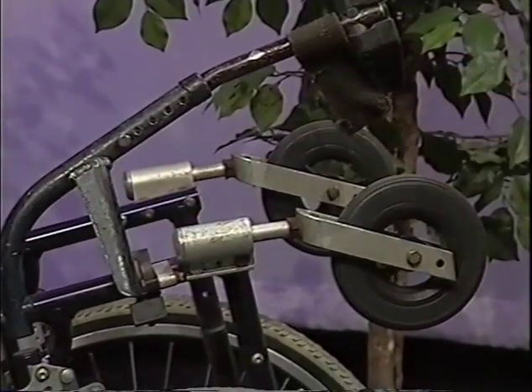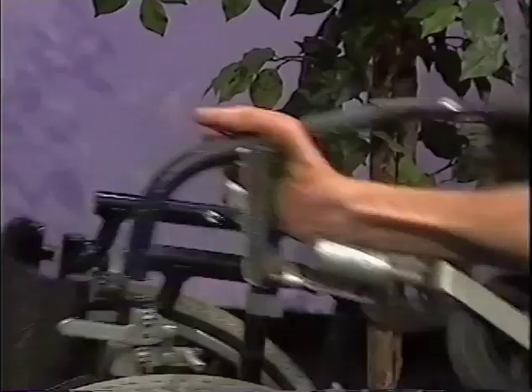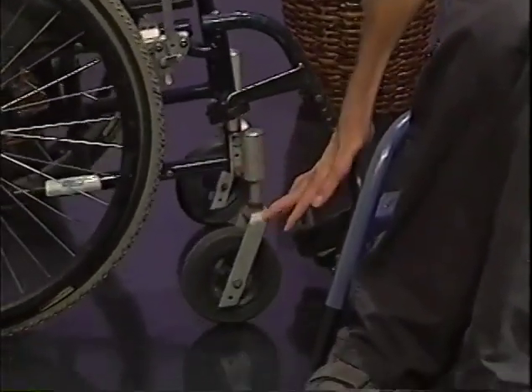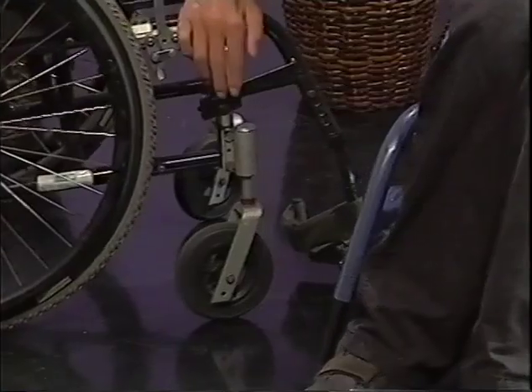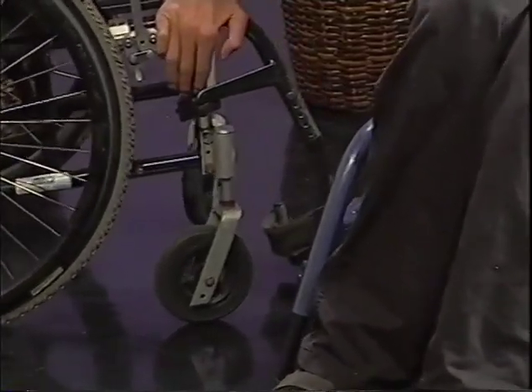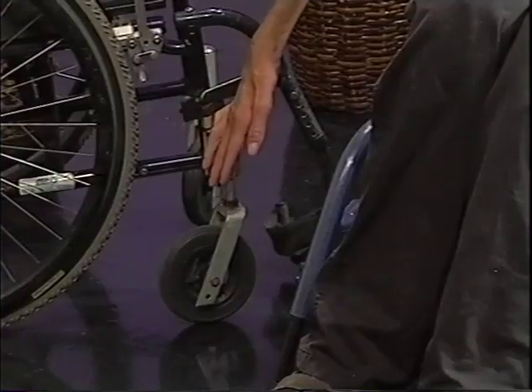This is a very important little piece that most people don't pay much attention to. When you have this chair sitting in the upright position, you can see that this fork is located in front of the down tube. So when you put pressure on this down tube, there's no way to lift the back wheels off the ground. The weight is carried behind the fork stems.